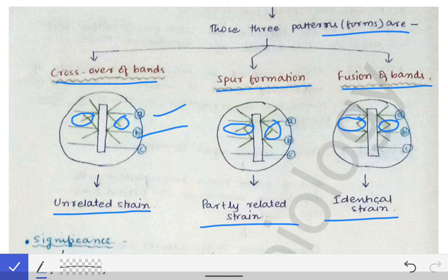Now, coming to the first one, why is it double diffusion? The double diffusion is because there is diffusion of antitoxin from this strip, plus there is diffusion of toxin from these streaks. Also, there is diffusion from the strip of filter paper as well. So from the filter paper there is diffusion of antitoxin, and from those streaks of the cultures there is diffusion of the toxins. That means two things are diffusing over that culture media, hence it is double diffusion.